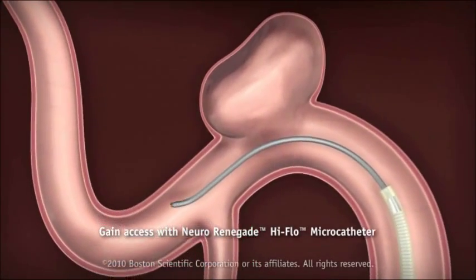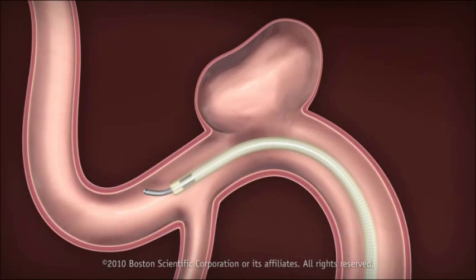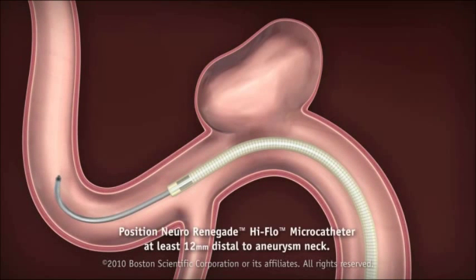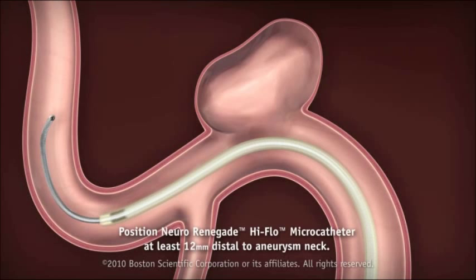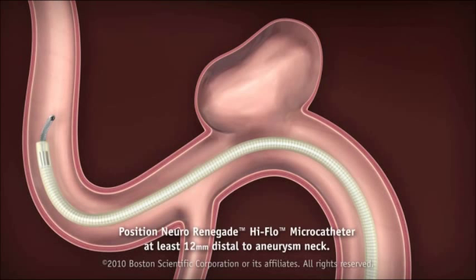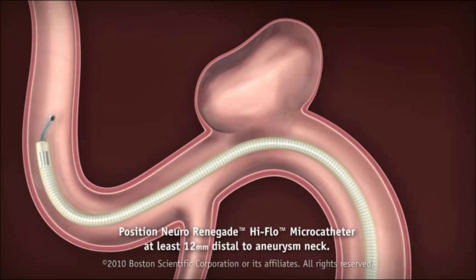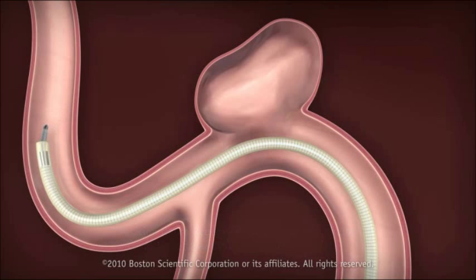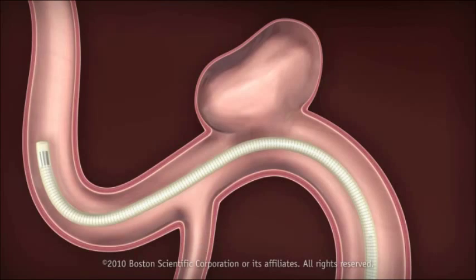Establish and maintain continuous flush with sterile heparinized saline through the microcatheter. Position the NeuroRenegade high flow microcatheter at least 12 mm distal to the aneurysm neck. Withdraw the guide wire, leaving the microcatheter in place.